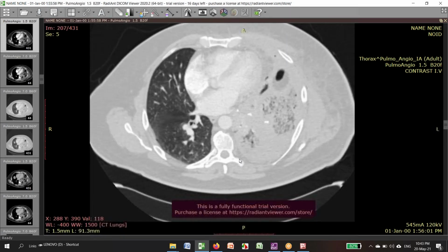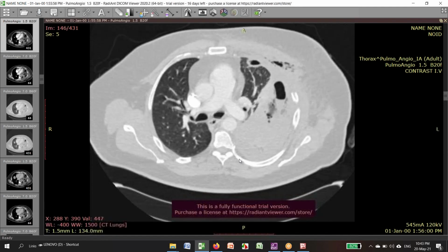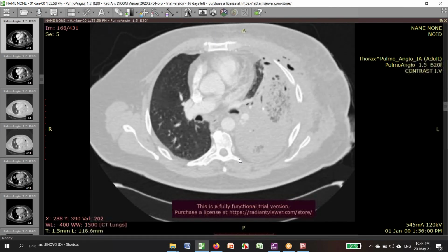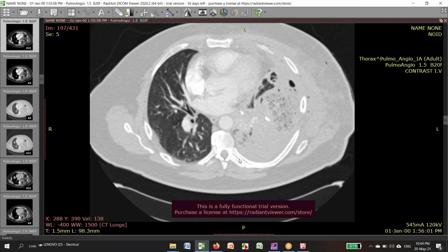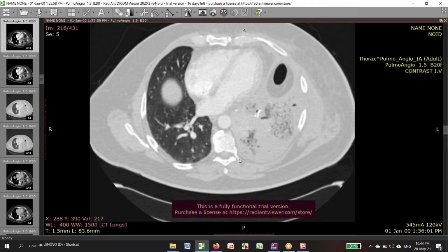Right, because typically with these complications, either with a torsion or just a venous infarct, and I've seen a couple of these too, I think what happens is they sometimes have variant venous anatomy, or their anatomy is a little different. So when the surgeon's in there with a scope, they typically try to identify the right one. But you can imagine in a small space with unusual branching, it's going to happen sometimes where you staple the wrong one, or your staple line goes too far, which is probably what happened in this case. But you're right, and it doesn't happen right away.